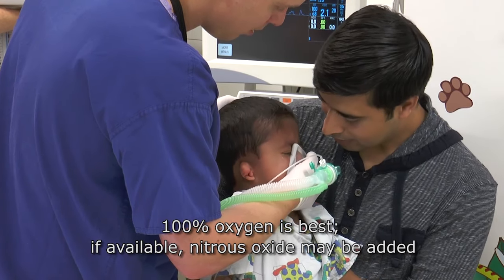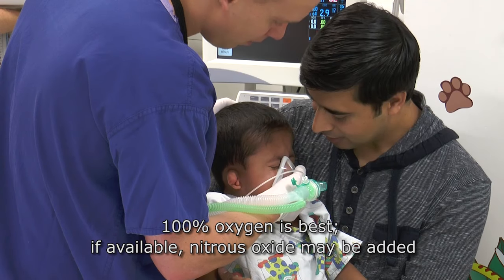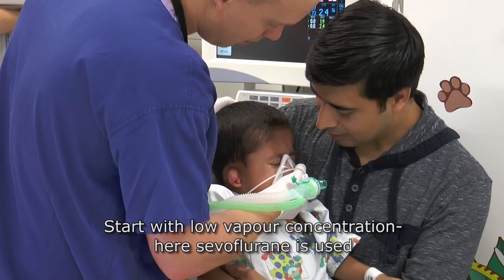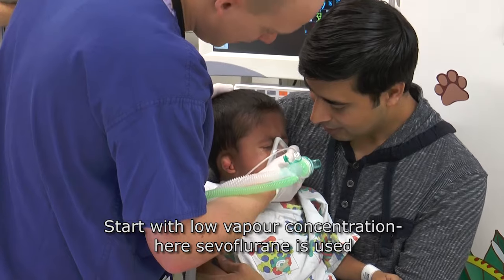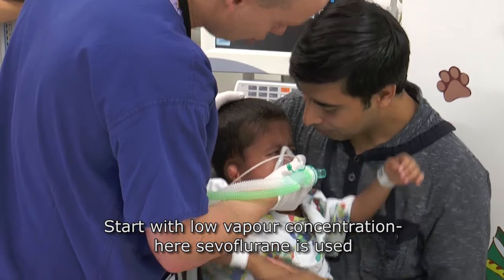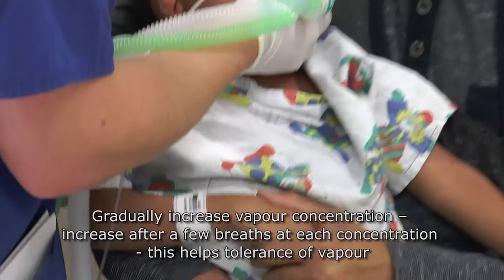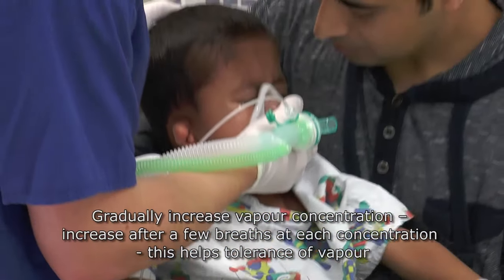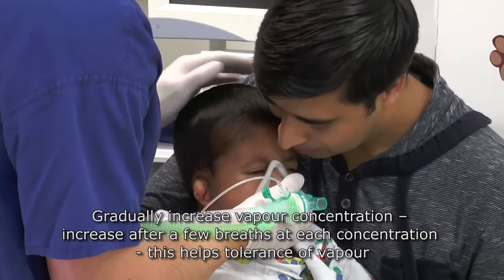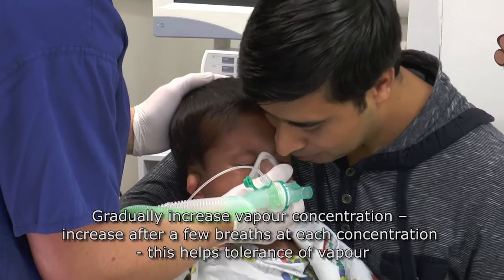100% oxygen is best. If available, nitrous oxide may be added. Start with low vapour concentration — here sevoflurane is used. Gradually increase vapour concentration, increasing after a few breaths at each concentration. This helps tolerance of vapour.